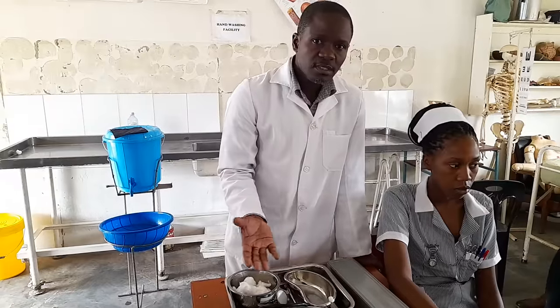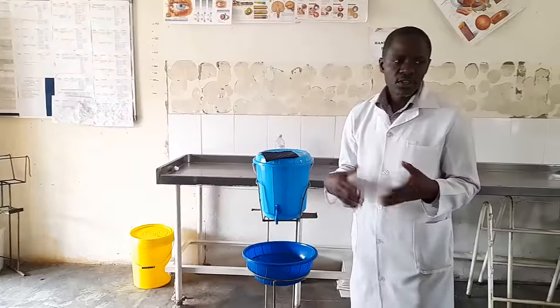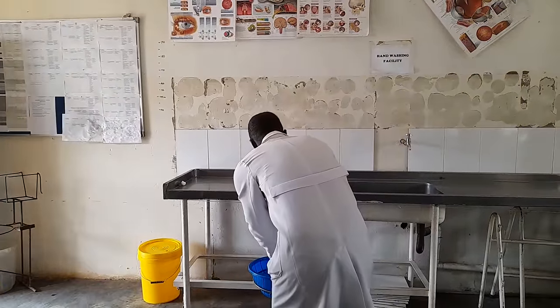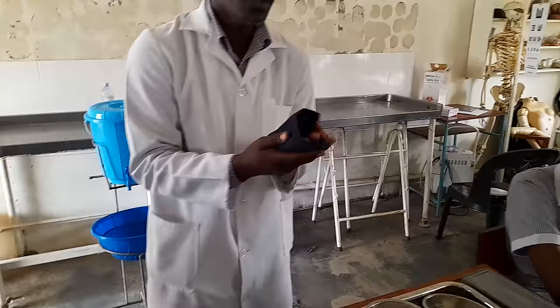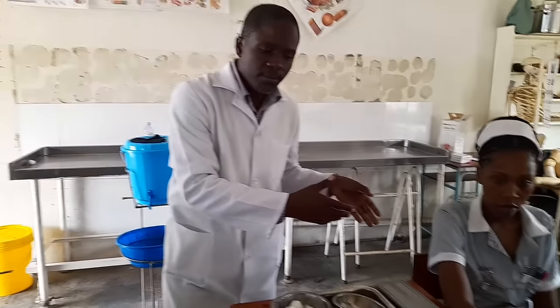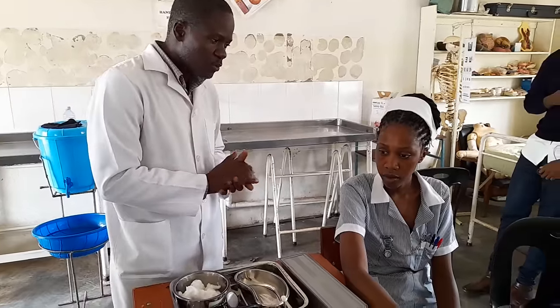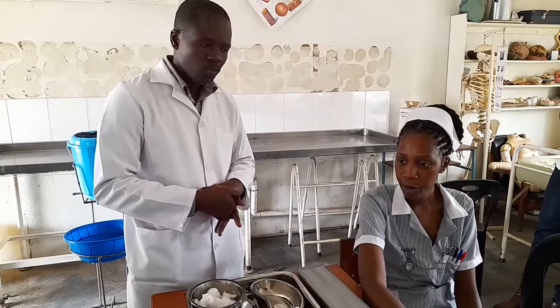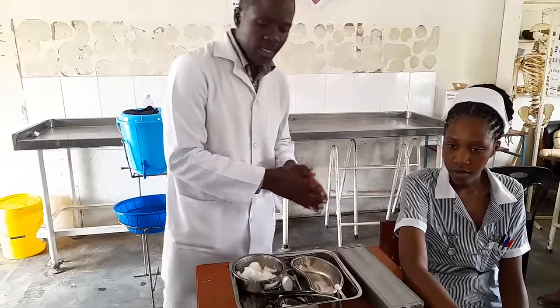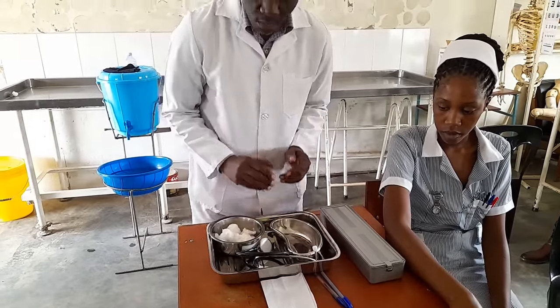The procedure starts always with hand washing — you have to go and do hand washing. In an OSCE, you have to be quick. Dry your hands. Then go to the patient and talk to them before you begin the procedure. Good morning madam. I'm student number two; I've come to do blood pressure on you. Is there anything I can do for you before I begin? Then prepare your equipment — in an OSCE you'll find it already prepared, so you can just go ahead and do the procedure.